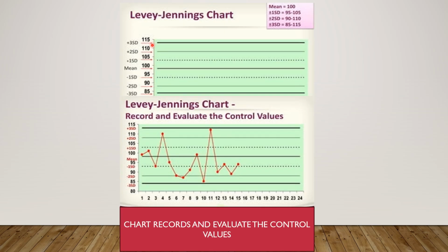So this is the Levey-Jennings chart. This chart is a type of statistical process control chart which is typically used in clinical laboratories for laboratory quality control application, in order to assess the quality and errors produced in the different instruments and samples.